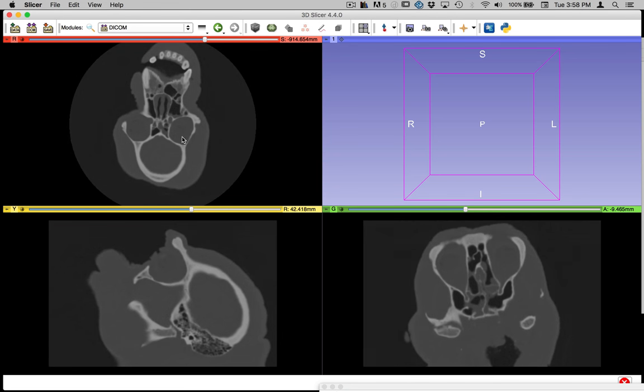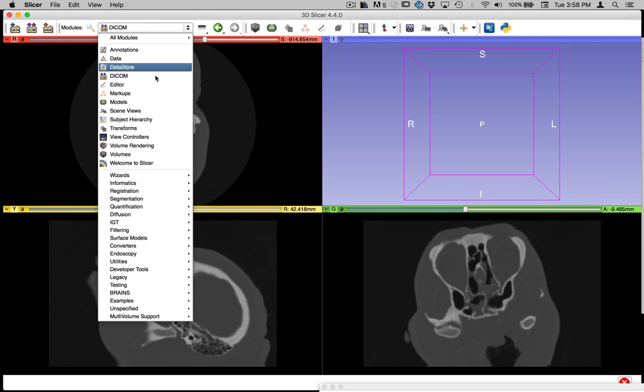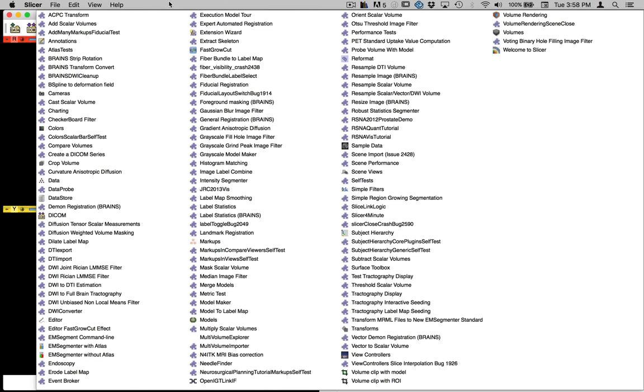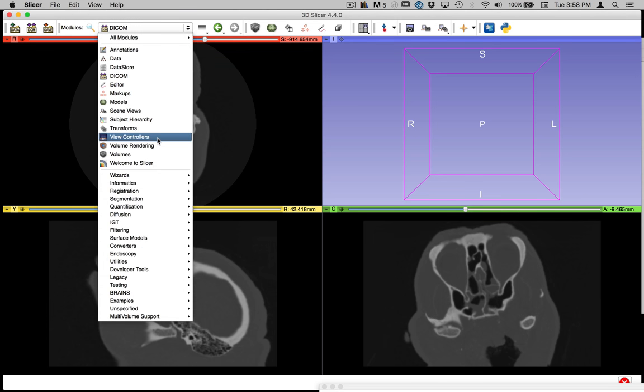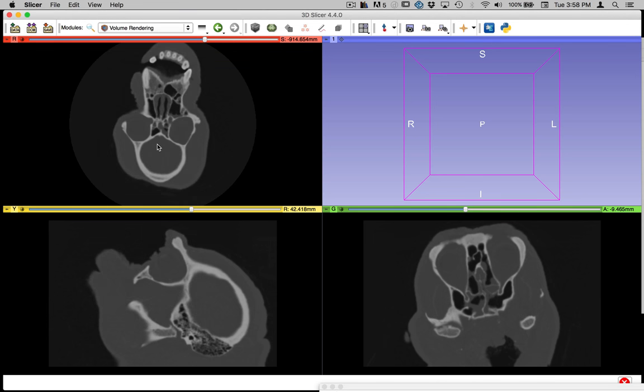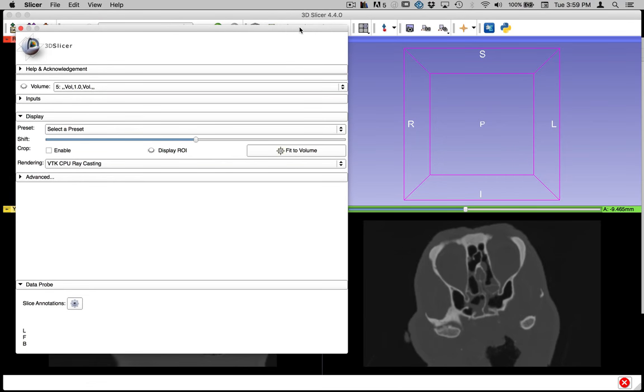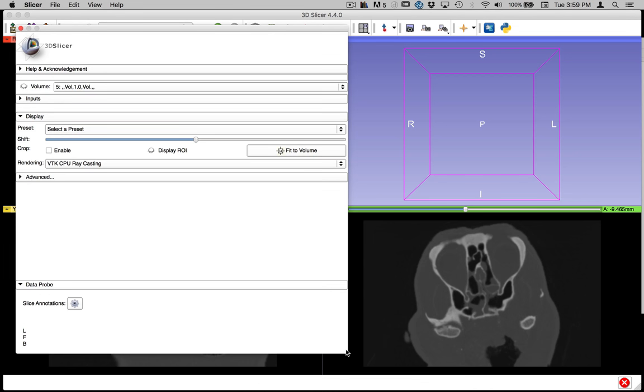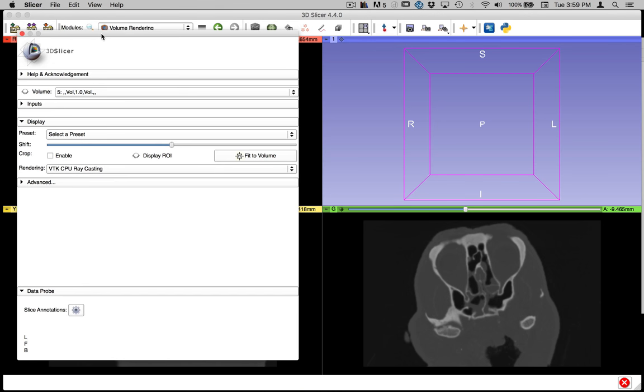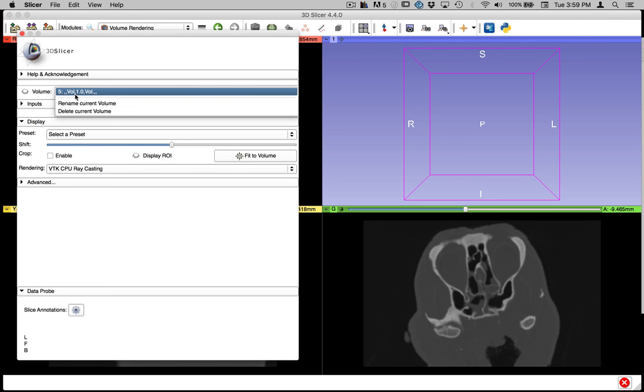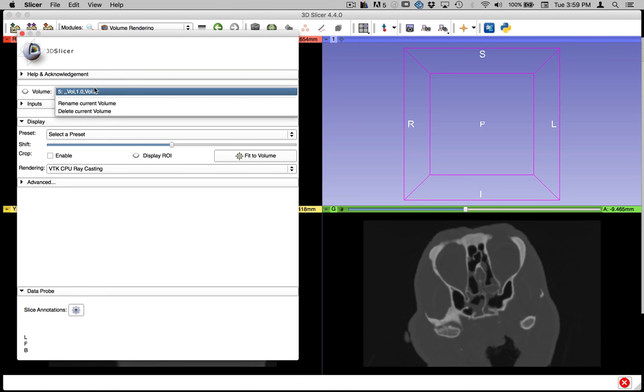So the first thing we can do from this is to generate a 3D representation of our model here. And we do that using the volume rendering module. And so you can see I used the drop-down menu here to go to volume rendering. And in the window that opens, we'll find the volume rendering module. Now, I have to say 3DSlicer is probably not well known for its inviting user interface, but it works. So we're in the volume rendering module here, and our volume is called volume comma one comma volume. Not a great name. We could rename it if we wanted to, but since we're just working with one in this file, it's fine.